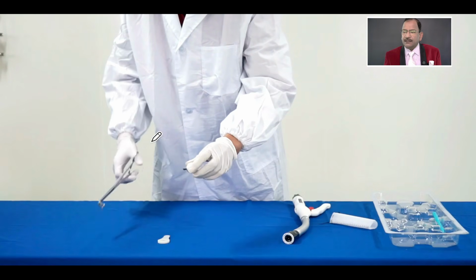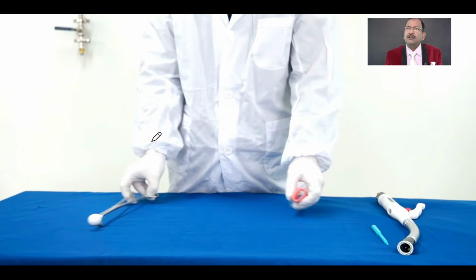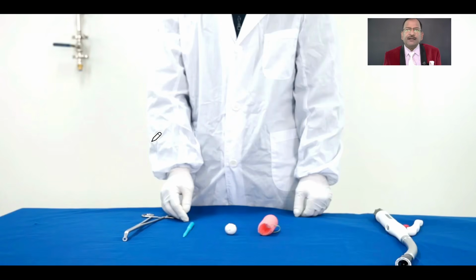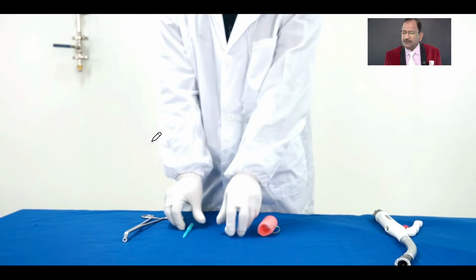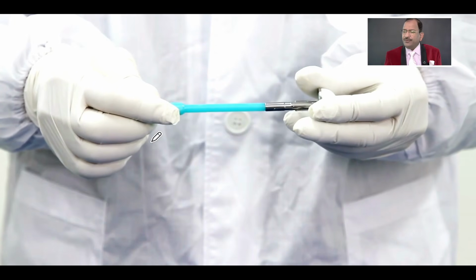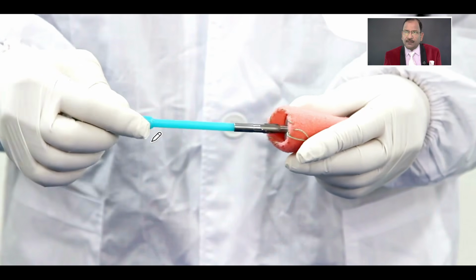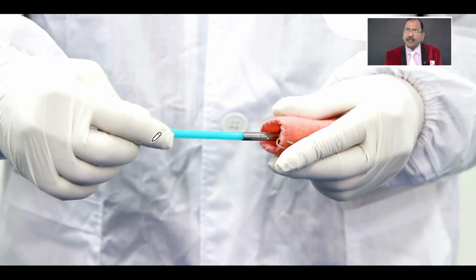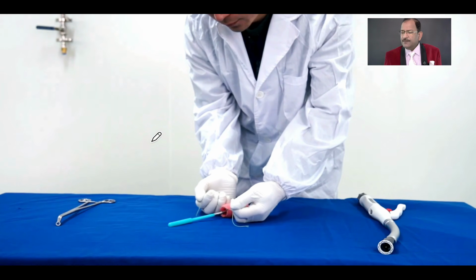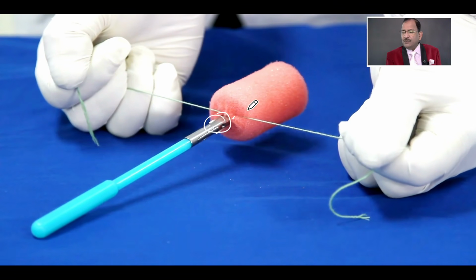And this is anvil. This is anvil holder. You will drop it into the proximal healthy part, the diseased part is cut out. And once it is introduced into the proximal healthy part, then you will tie the purse-string which you have already taken. And this purse-string should be completely tight, completely, there is no leak.